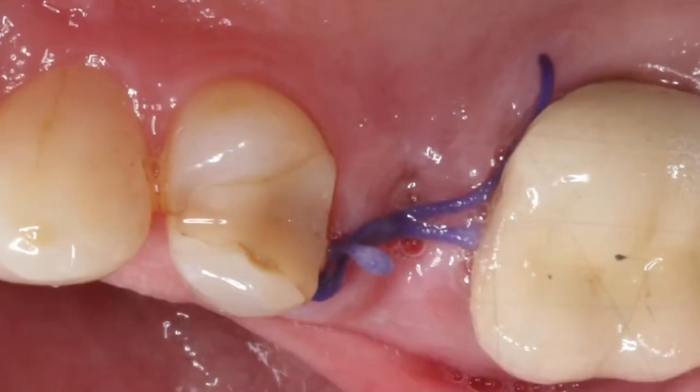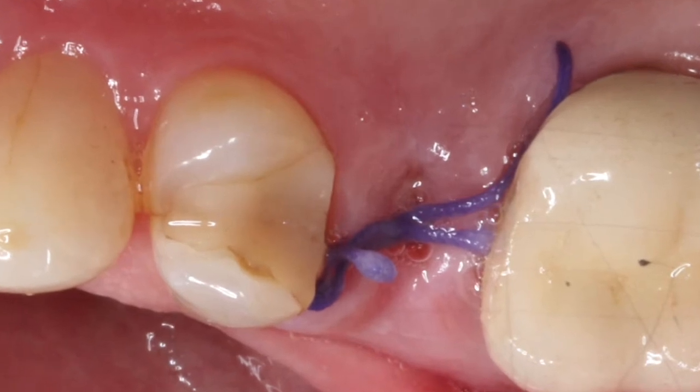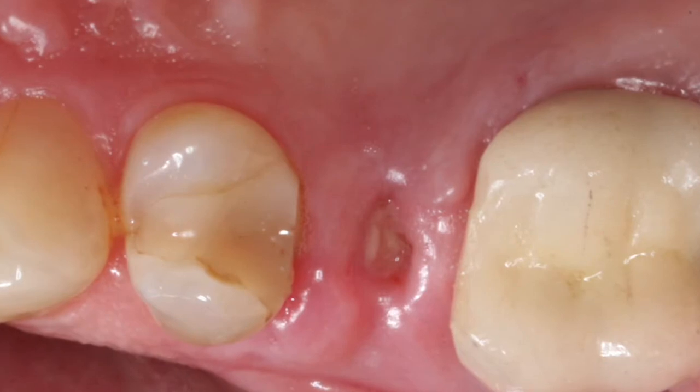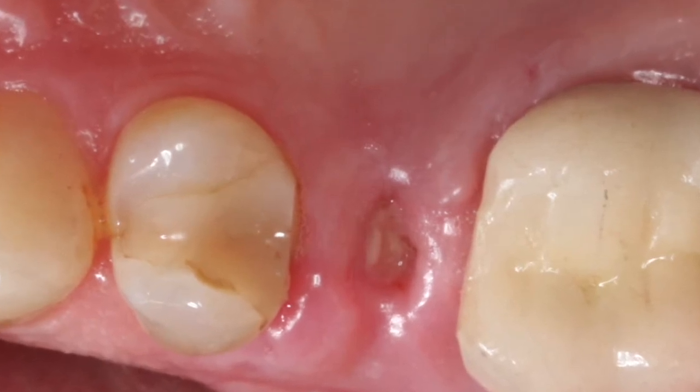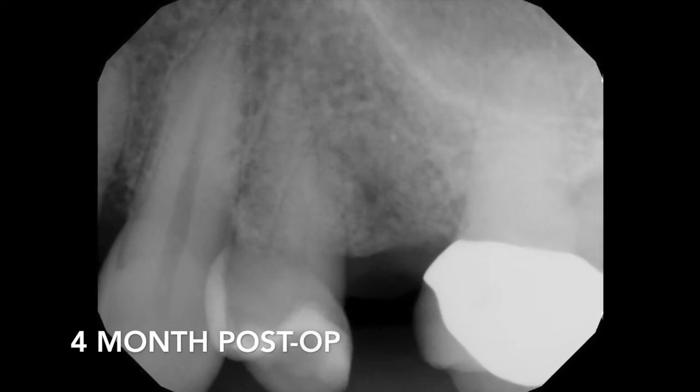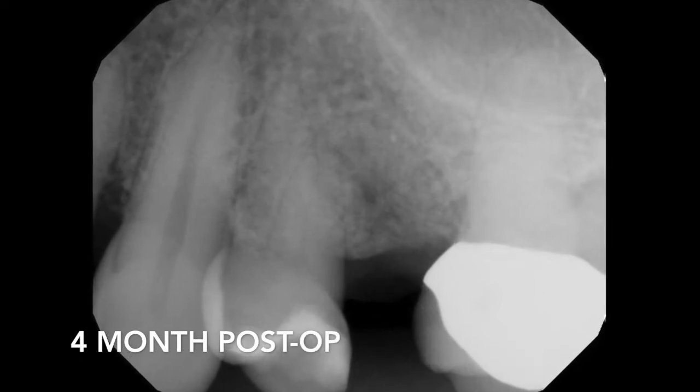This is going to fill in with bone over a period of time very, very well. At one-week postoperative, you can see the epithelium is already granulating through, and you can see just a little bit of the graft material still in place. After four months, you can see a definite change in the quality of bone present.